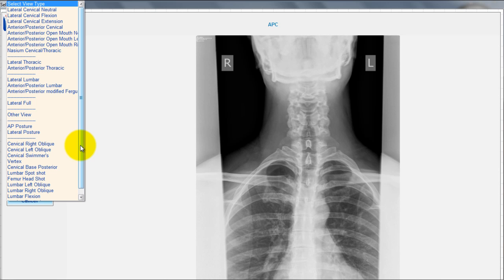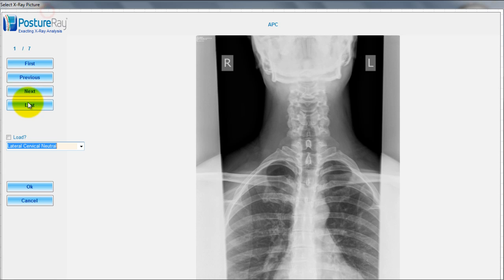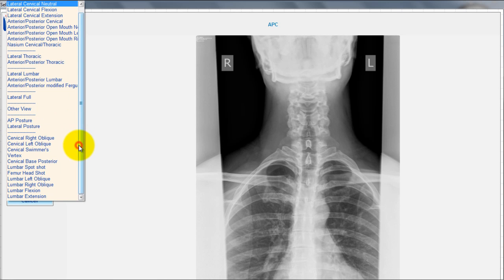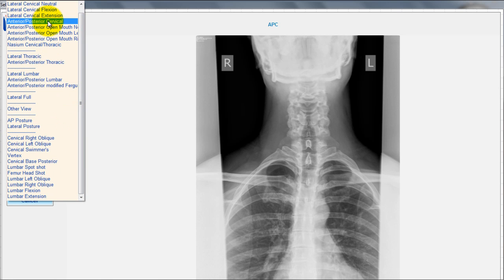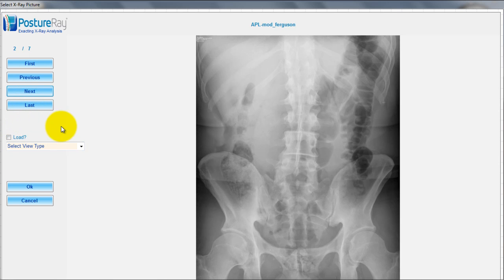What your staff needs to do is simply map what these are. Now, everything I'm showing you at this point, a CA could absolutely do. So I'm going to say this is an AP cervical. And notice that it's the patient facing us. We always want to have the right facing us on our left side. Unlike what we were taught in chiropractic college, we're doing this as medical views. And I will explain why as we go. So this is AP cervical. We're going to hit load.